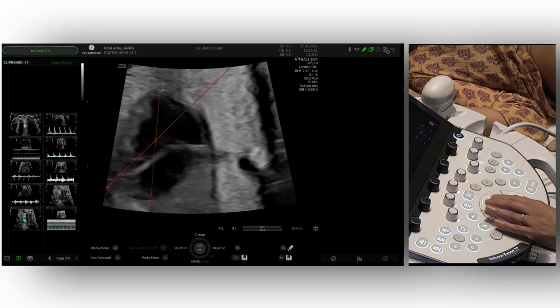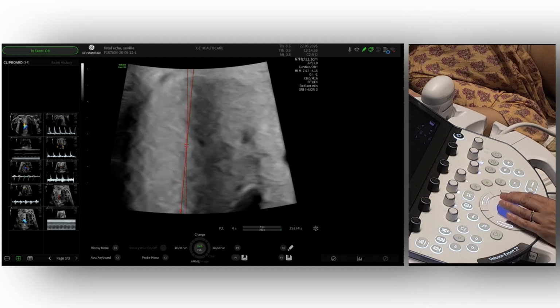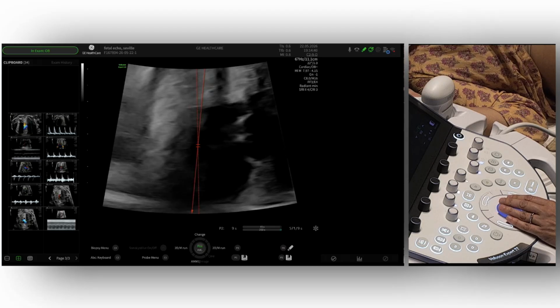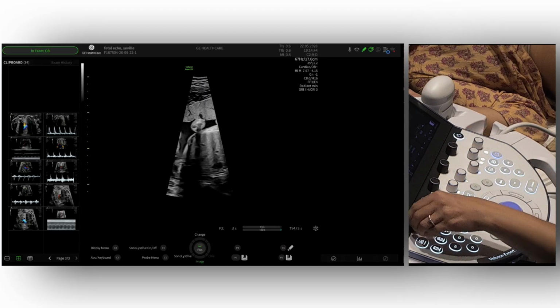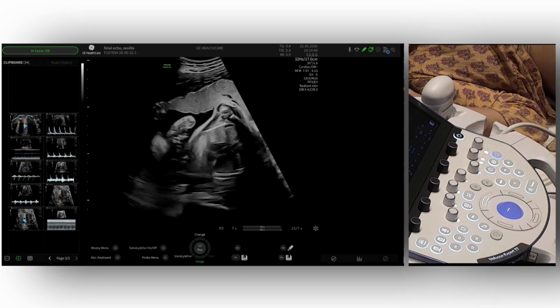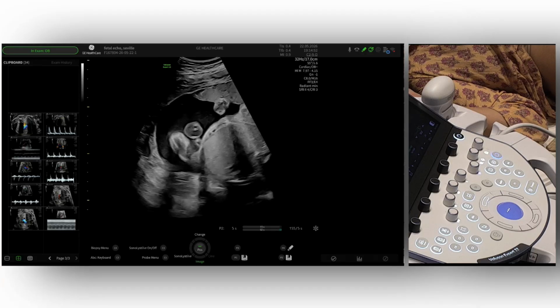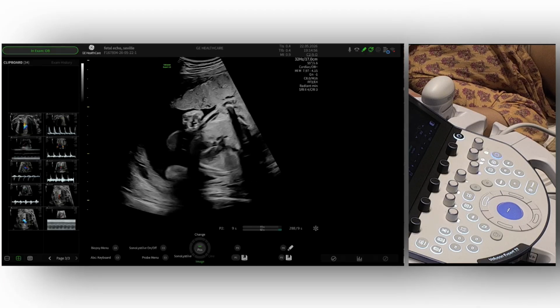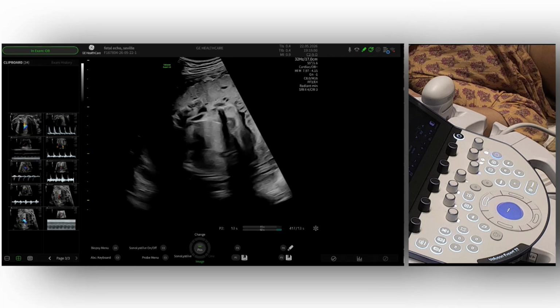Are there any questions from the floor, folks? Fatima, you started off very nicely. The first thing you do is look for an arterial pulse. Then you move to the aorta and mitral valve, then to the left brachiocephalic vein, and then you follow by M mode.